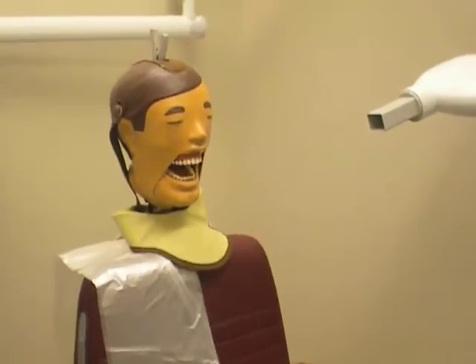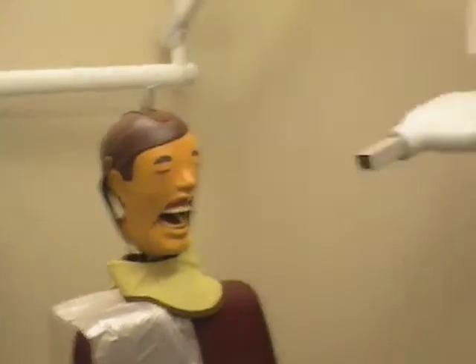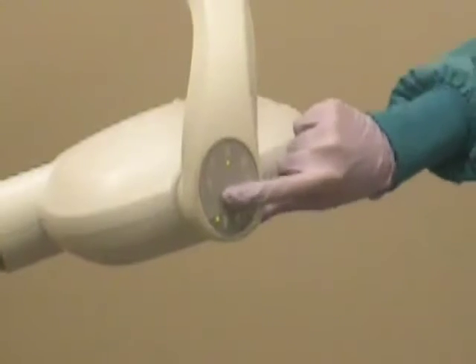Before taking the radiograph, the X-ray unit will need to be turned on. Select the appropriate setting depending on whether your patient is an adult or a child. On the X-ray tube, press the button to select the anterior tooth.